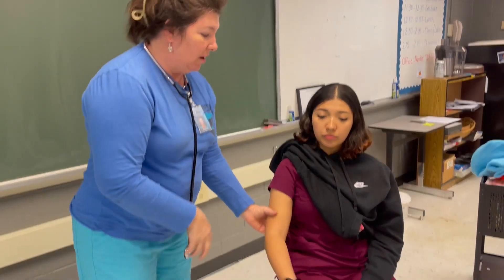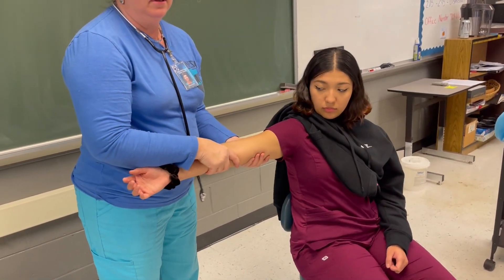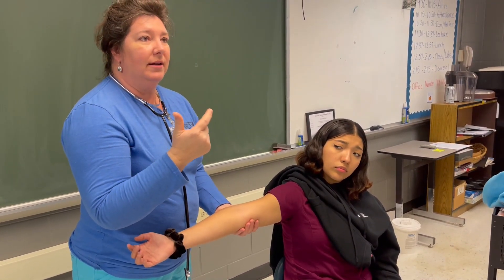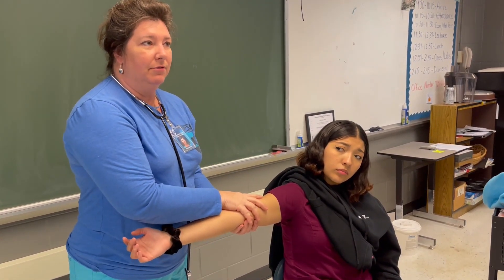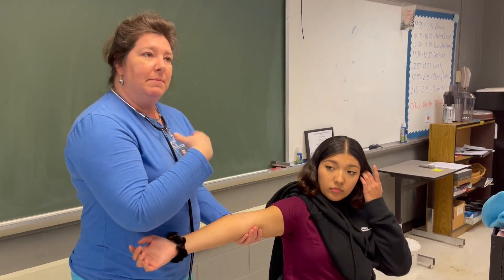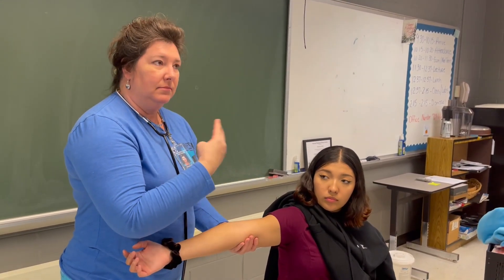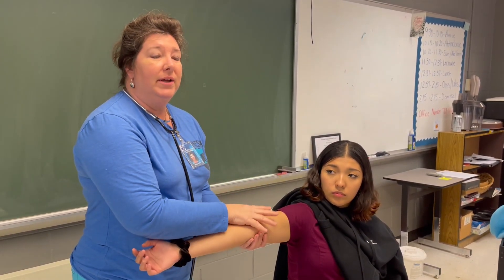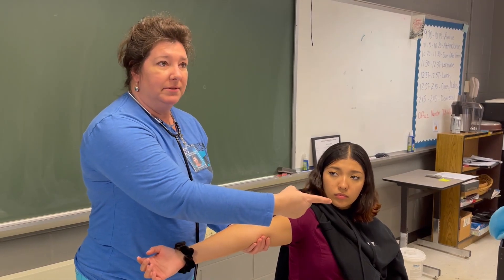The other thing is, once I take her blood pressure, if I mess up and I let it go too quick, I have to wait one minute before I can take it again. If I mess it up again, then I need to wait another minute. Three chances is all you get, and then you have to switch arms, because you can actually hurt somebody doing this.